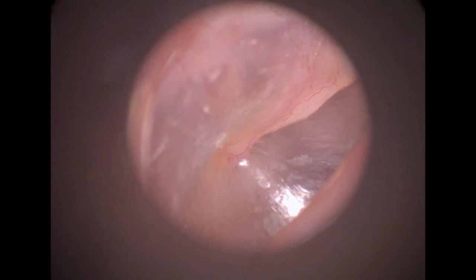If there is no clear view of the tympanic membrane, there might be excessive earwax in the ear canal. Clear the patient's ears and take a new photo. As a general guideline, use autofocus when there is a clear view of the tympanic membrane and manual focus when the ear canal is narrow or the view is bad because of a hairy ear canal.